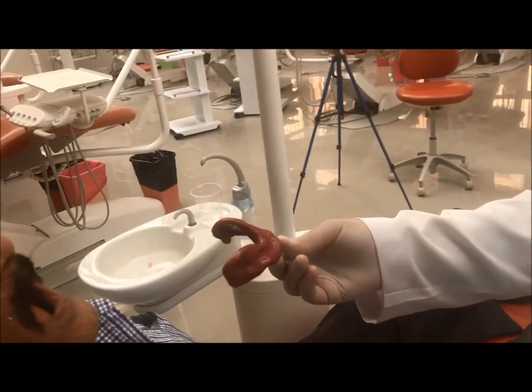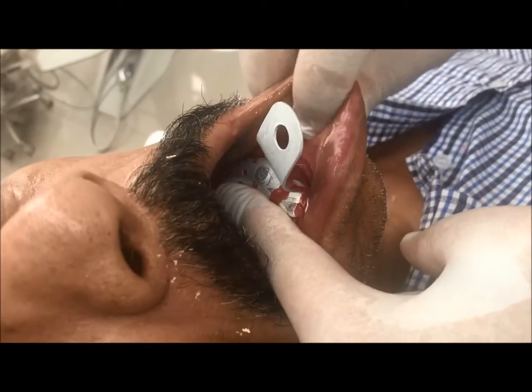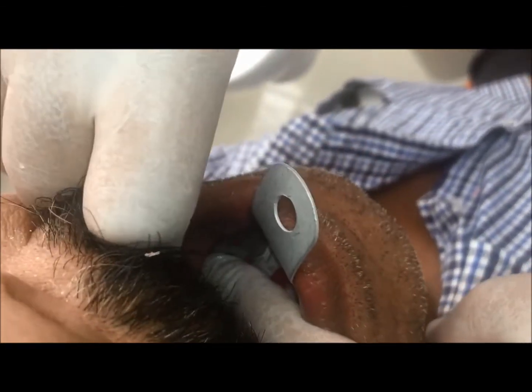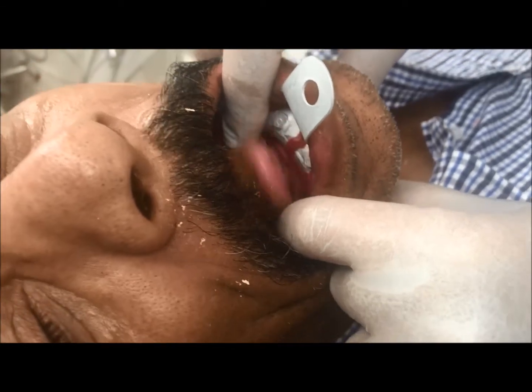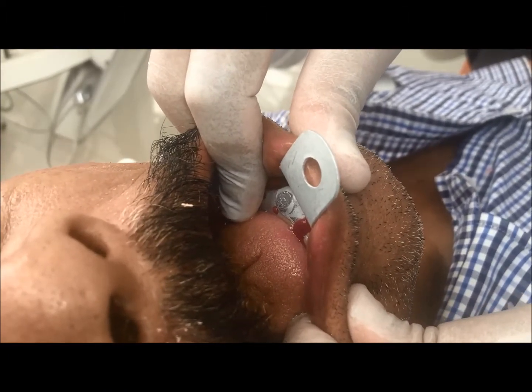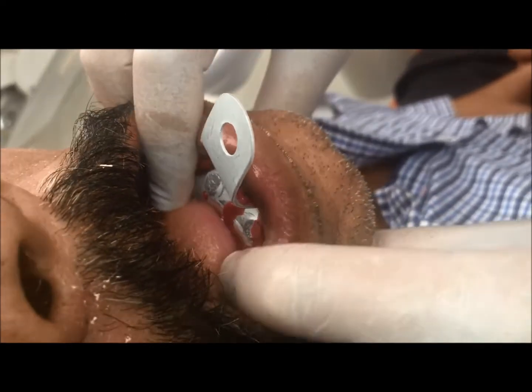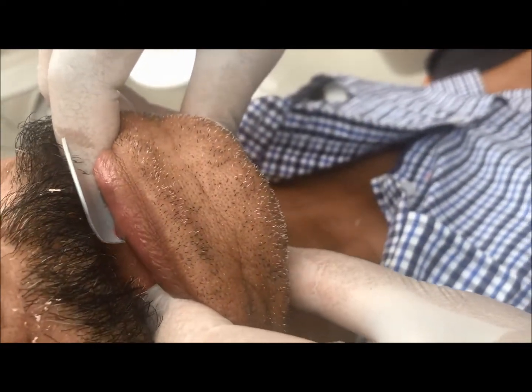I stand in front of the patient, rotate the tray, insert the tray, apply pressure, then perform border movement — moving the cheek upward and inward — until the disto-buccal area, where the patient closes against my hands. I move the cheek upward and inward on the other side by the same technique. Lingually, the patient moves the tongue while it remains inside the mouth, so that it is a normal physiological movement. Never ask the patient to protrude the tongue outside the mouth, as this is not a physiological movement. I keep the tray in position with my fingers over it and my thumbs holding the mandible.